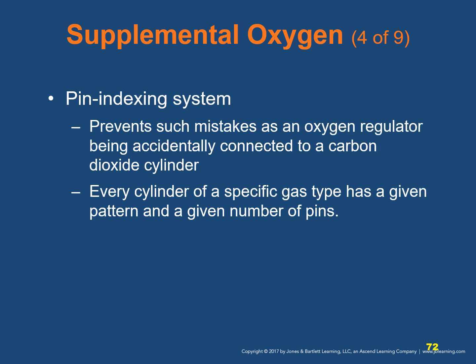Now, the pin indexing system prevents such mistakes as an oxygen regulator being accidentally connected to a carbon dioxide cylinder. When preparing to administer oxygen, check that the pinholes on the cylinder exactly match the corresponding pins on the regulator. Each cylinder of a specific type of gas has a given pattern, given number of pins, following accepted national standards.